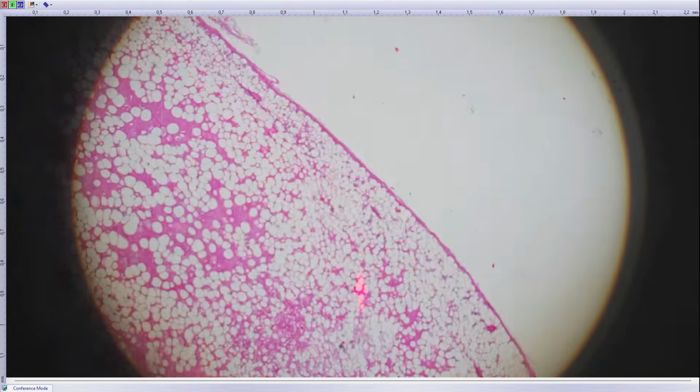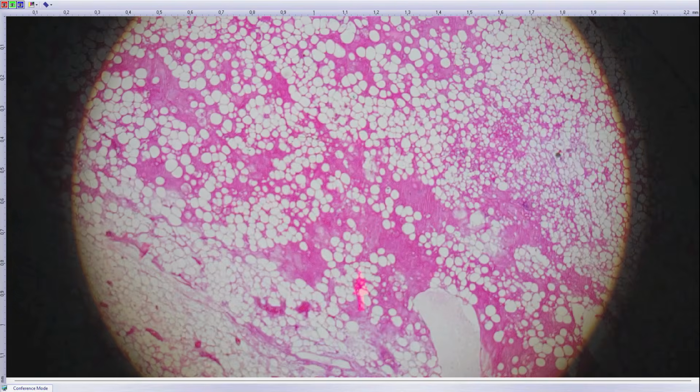Yeah, and here, it's very rare. Yeah, it's super rare. I've never seen one in a real setting, neither in consultation nor in routine. We have some, but I haven't seen it for years now.